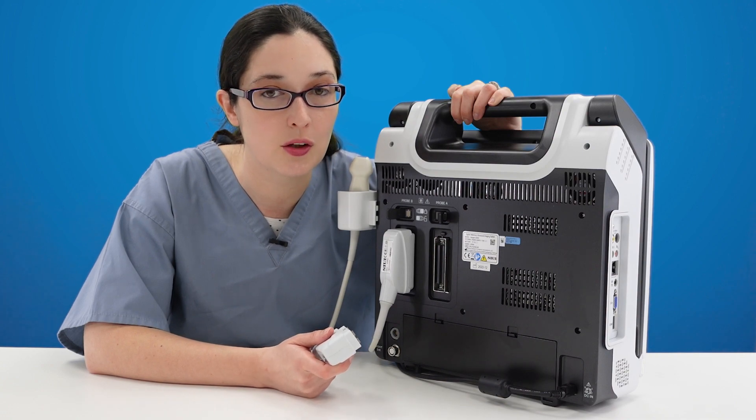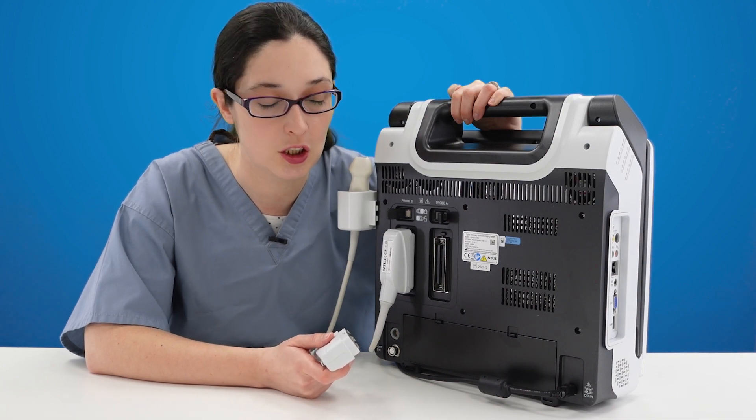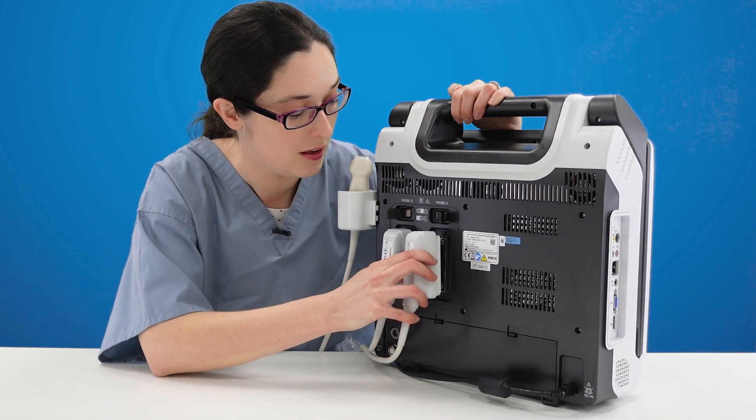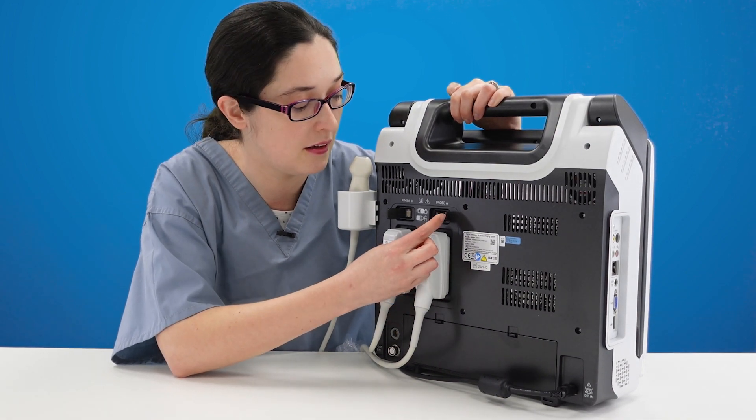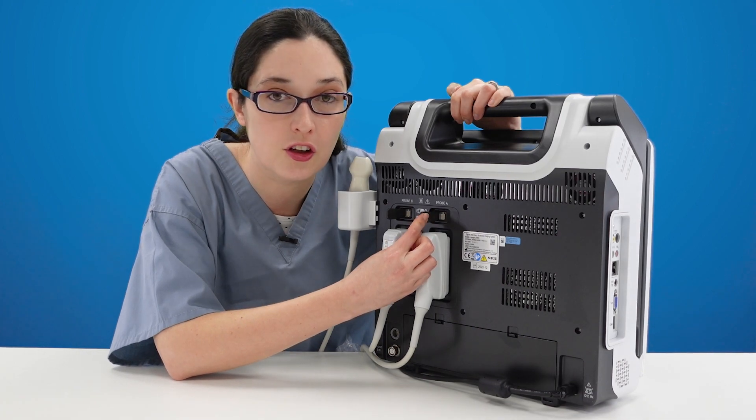It's really easy to attach and detach your probes. Simply put it in the probe socket and secure.